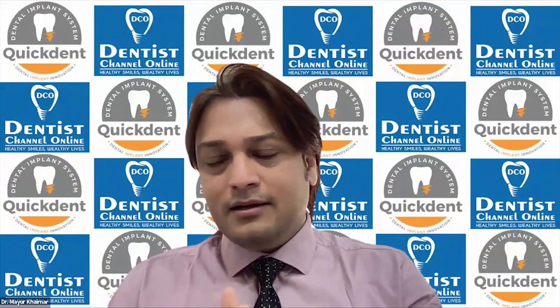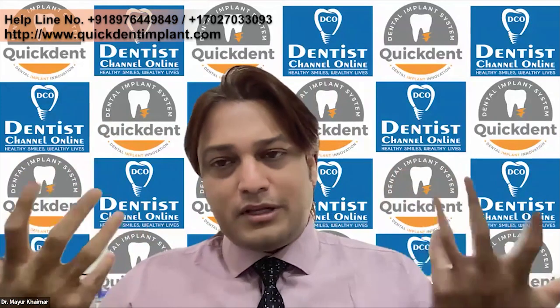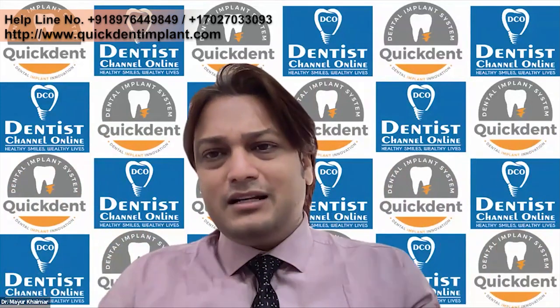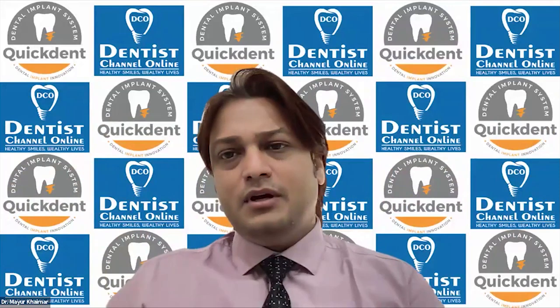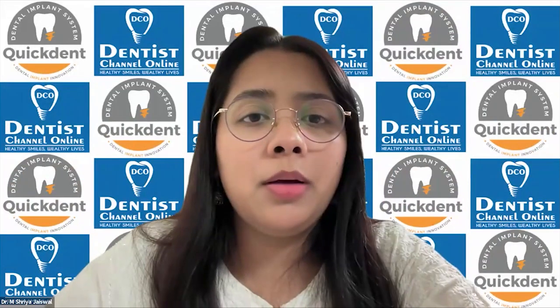I showed you one lady. So you don't have to satisfy the ego of immediate loading. You just go with the science. Let the osseointegration happen with time. Now bone will form there nicely. Yes. Next is from Amit Gilani.